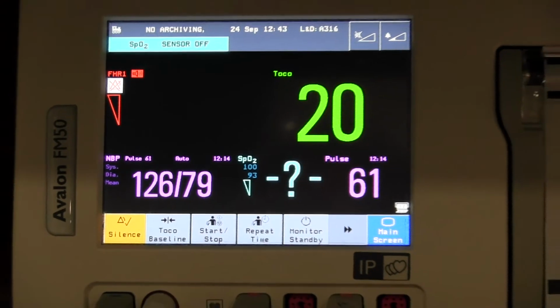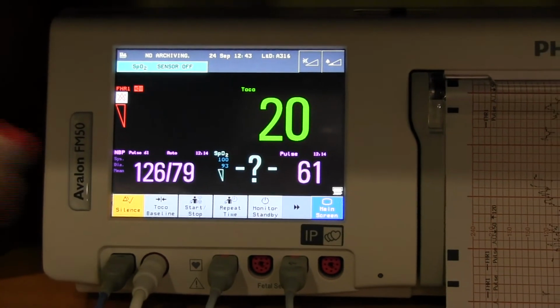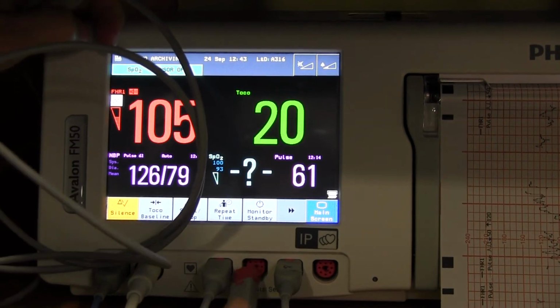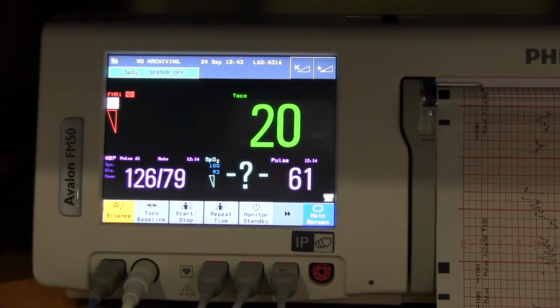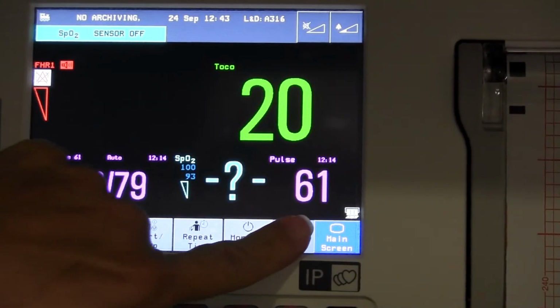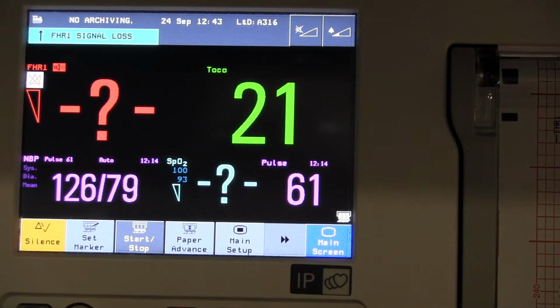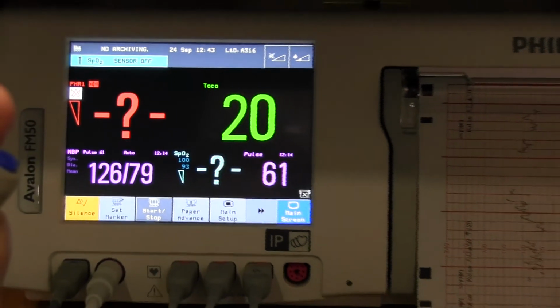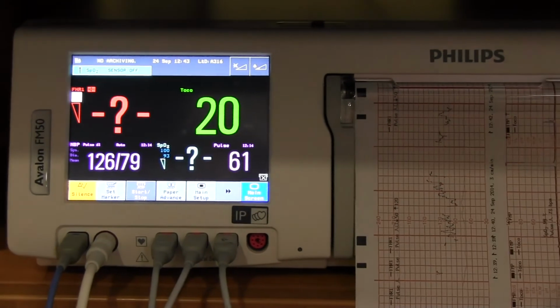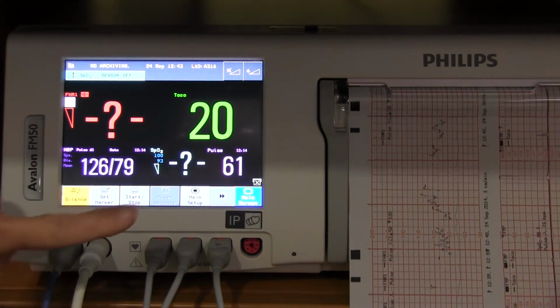To mark an event, connect the remote event marker to a free fetal sensor socket. Start the recorder. Press the button on the event marker. A small arrow is printed on the heart rate scale on the trace paper. The Set Marker smart key can also be used to place a mark on the paper.